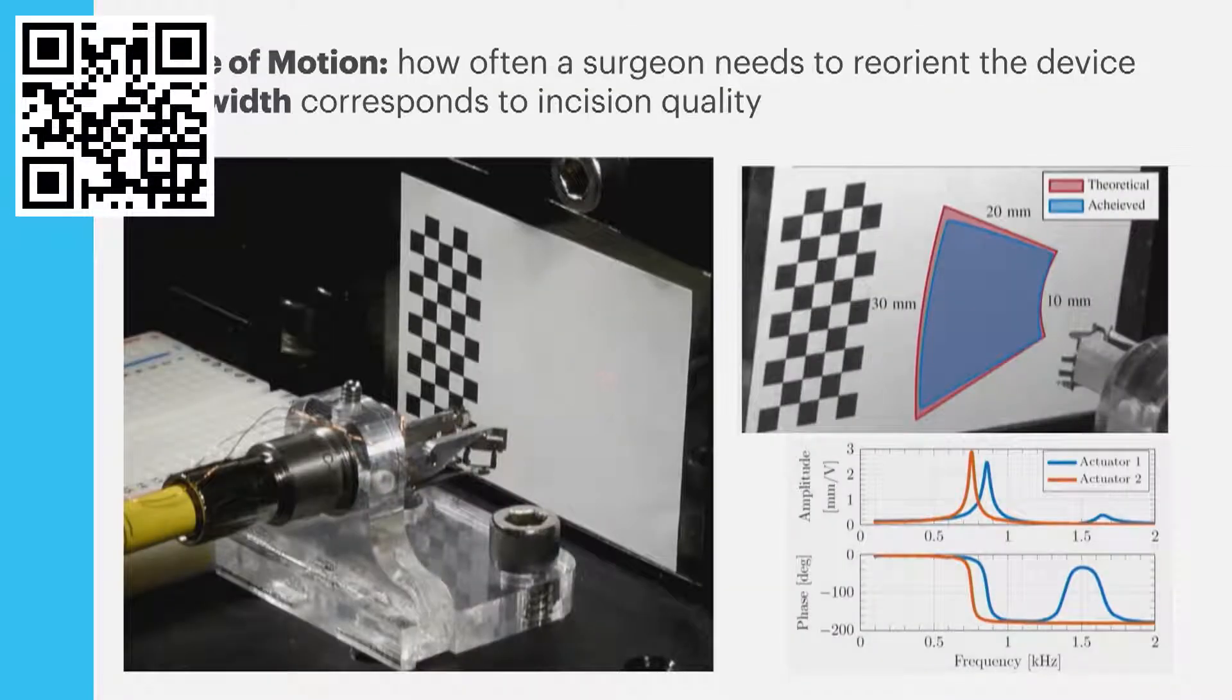We really care about the range of motion and the bandwidth. The range of motion corresponds to the size of lesion and how often the surgeon needs to reorient the device. Each axis has plus or minus 12 degrees of motion. At a 20 millimeter standoff that corresponds to this nice large range of motion. We also have quite high bandwidth on the order of 500 hertz, resonant frequencies of 750 and 850 hertz for these two axes.